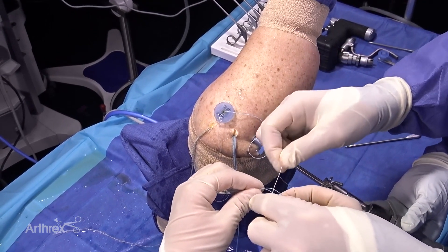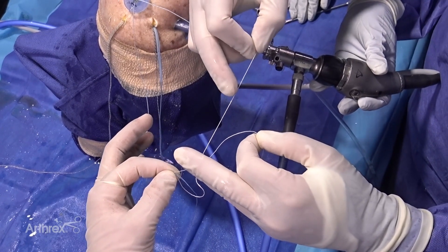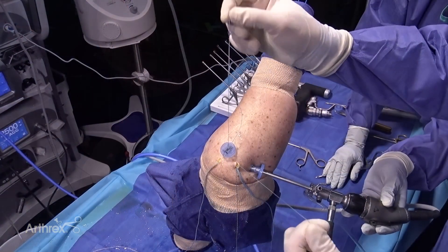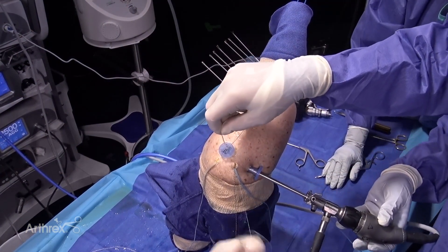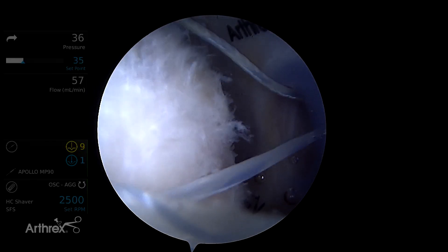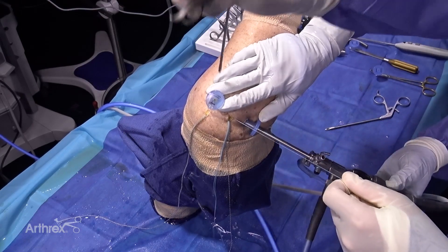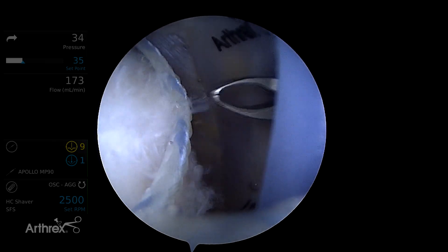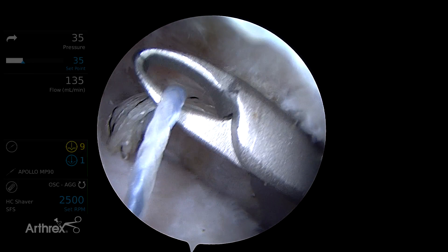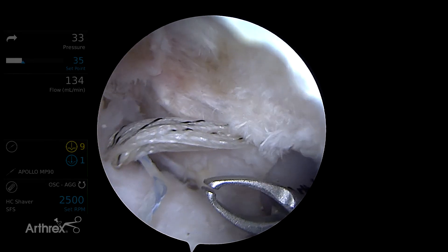I've threaded this working suture through the loop of the passing suture — this is the junction of the white with the blue and white stripe. So now we're going to pull on the pulling end of our threading suture. I'm going to pull this so that it still kind of sits above that segment of the cuff — I'm not going to take all the slack out, but just want to get it out of the way of threading the other splice.